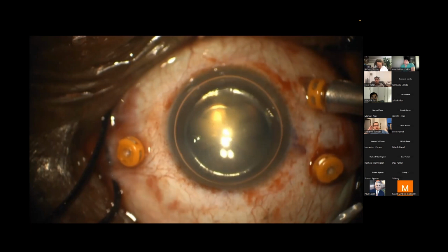Yes, I mean, unless you're going to do a PPL, you have to put fluid back in the eye so that you can do the cataract anteriorly, and you're going to redetach the retina that you just flattened. Then you have to put PFO back in. You kind of have to restart the whole surgery if you're going to do it anteriorly, unless you're going to do a PPL. Yeah, and even PPL you can't do under air, right? Or it'd be pretty risky to do under air.